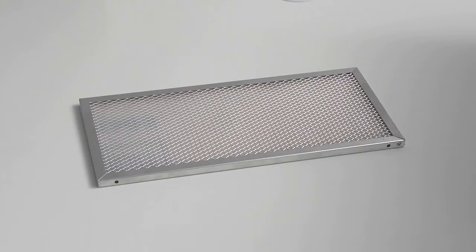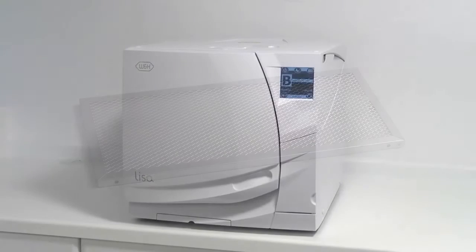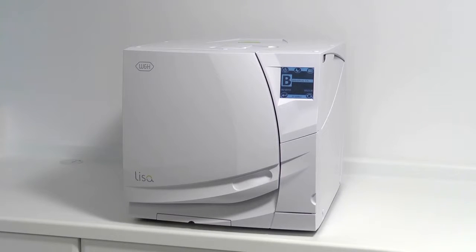The dust filter is an essential component of your W&H Lisa steriliser. It filters the air passing through the internal components in order to provide effective cooling. The filter can be found directly beneath the main door.